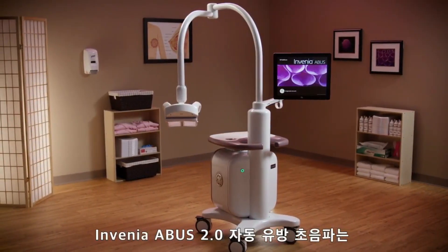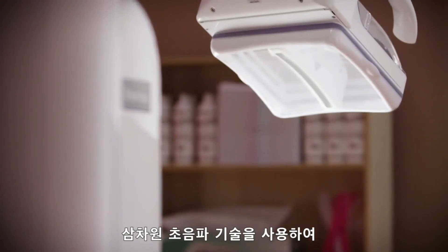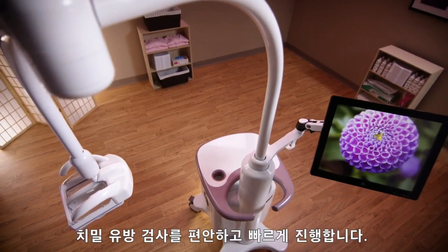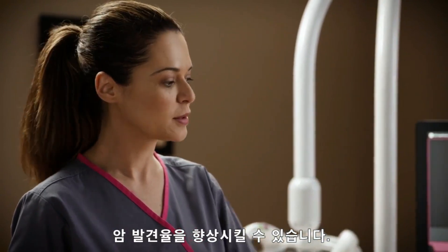Invenia Abus 2.0 Automated Breast Ultrasound System uses 3D ultrasound technology to comfortably and quickly image women with dense breast tissue. Invenia Abus has been proven to improve cancer detection when added to mammography.